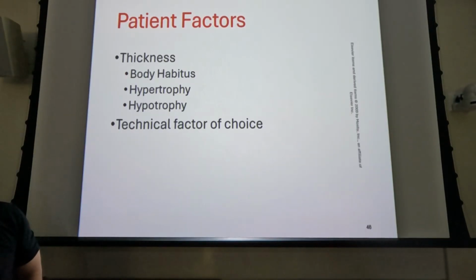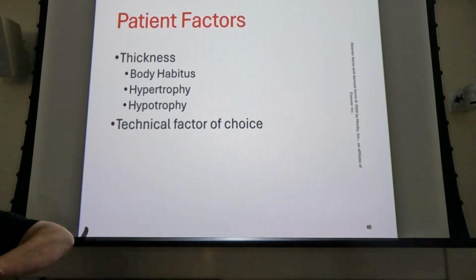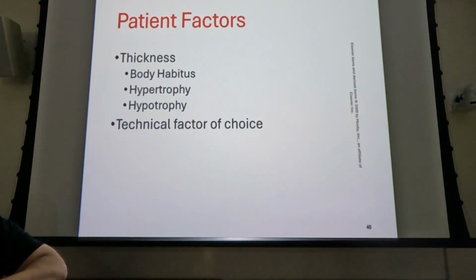Did you say high patient density is like the low radiographic density? Exactly. So bone, high patient density, is very light on the image, so it's low density on the image. Yep. Anything else?